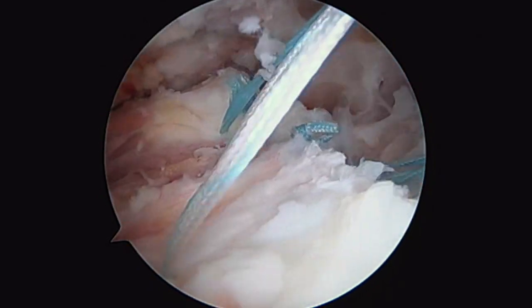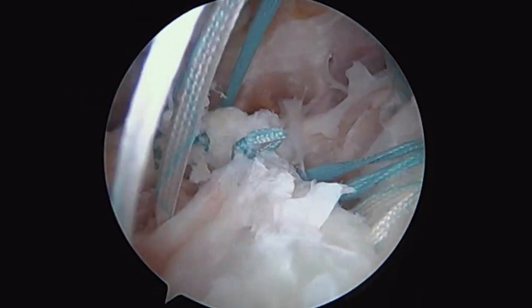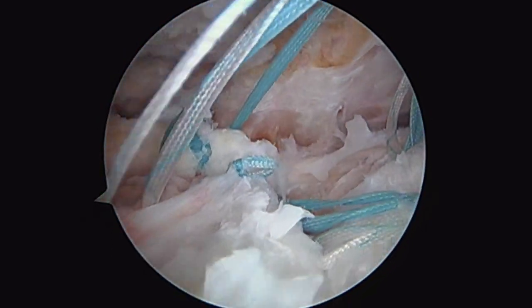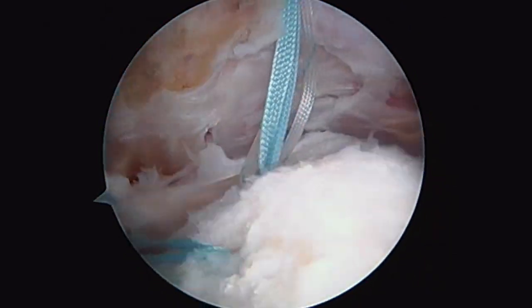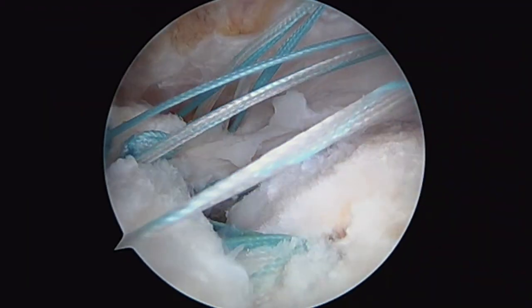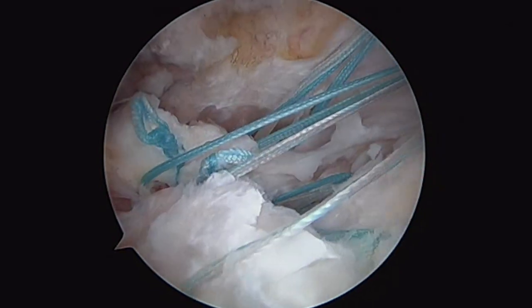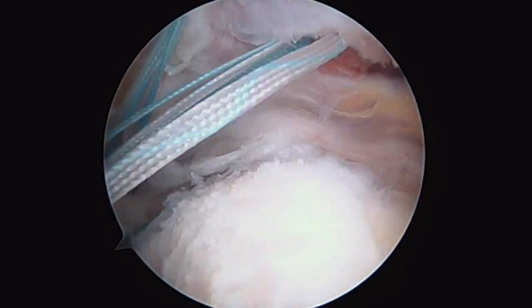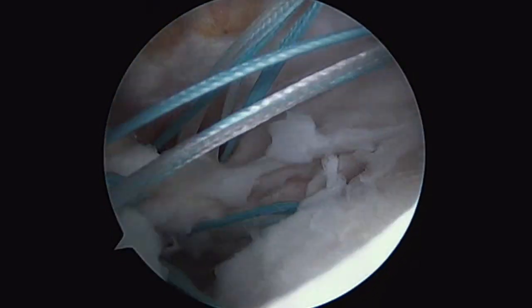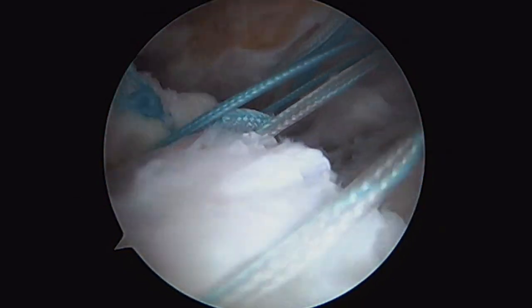Part 3A is done. We've passed horizontal mattress one with the white and then blue with our posterior anchor — you can see all the suture going through the cuff. Now we're going to work on these anterior anchors, which will fill up that space. We're going to have four horizontal mattress sutures in total, then bring them out laterally. Part 3B is complete. You can see our posterior anchor and our anterior anchor in the front. I've passed four horizontal mattress sutures — all the sutures from the posterior aspect of the cuff brought out anteriorly — hopefully bringing all of this posterior tissue more anteriorly to give us coverage of the humeral head.